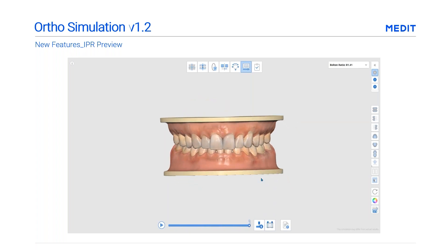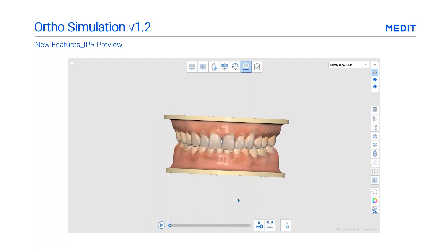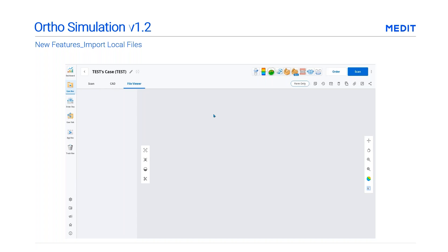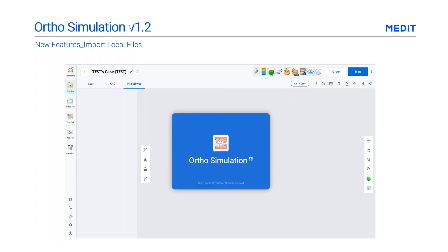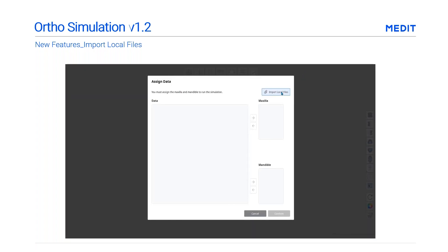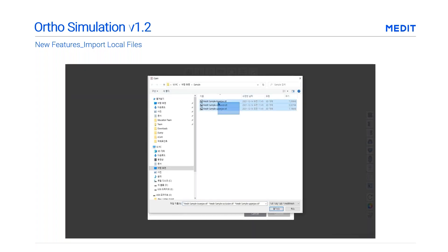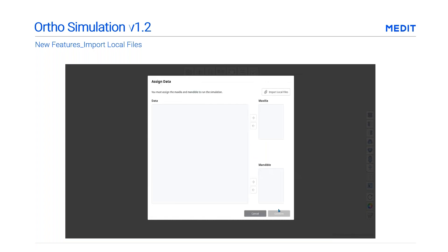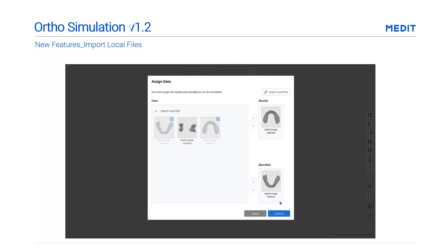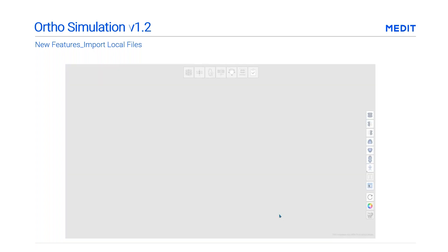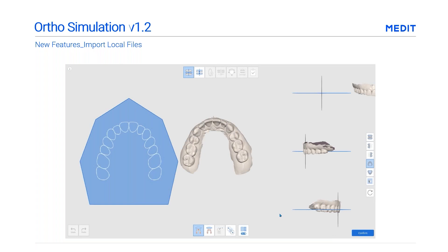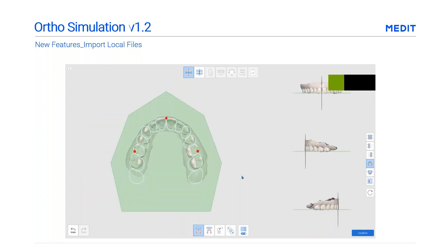As you will see by the tools depicted here on the screen, you can now utilize both the assorted maxilla and mandible data generated from Medit scan programs and internal data added via the attach function for simulations. You can now import files directly from the computer and run simulations without accessing Medit Link. Once you import the local file or attachment file, an align to the occlusal plane stage will be added before the model setting stage.